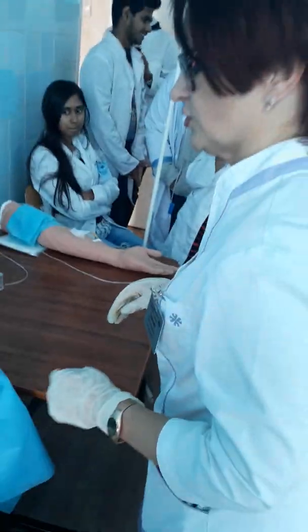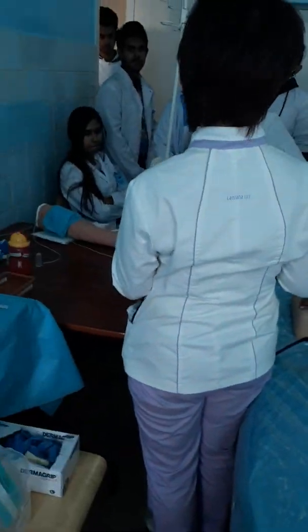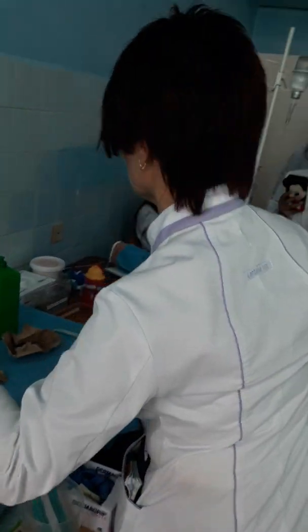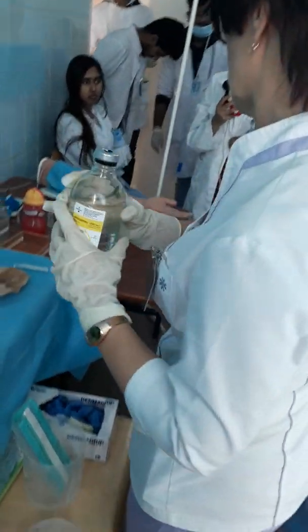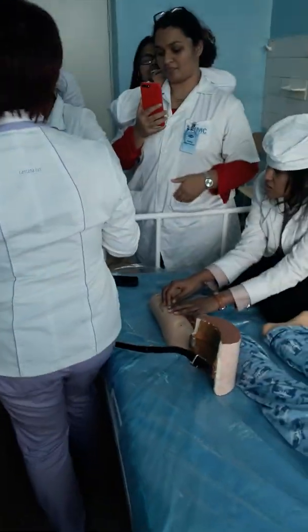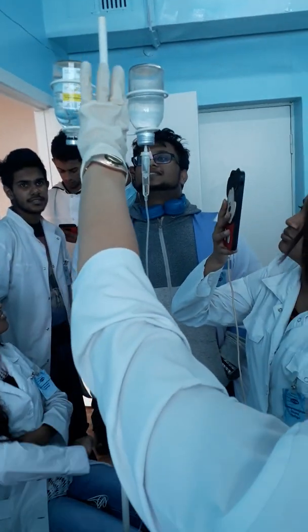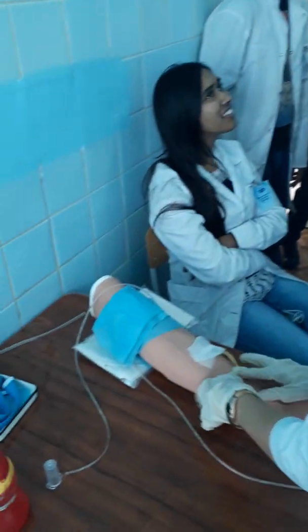Next, your patient needs additional medicine, not only one. You must change this vial, for example, when it is finished. You finish administering, and your patient needs a new solution. You check and prepare this solution, clean it twice like for the others, and when your vial is ready to work, you place it on the free part of the stand. Explain to the patient: now I change the solution.